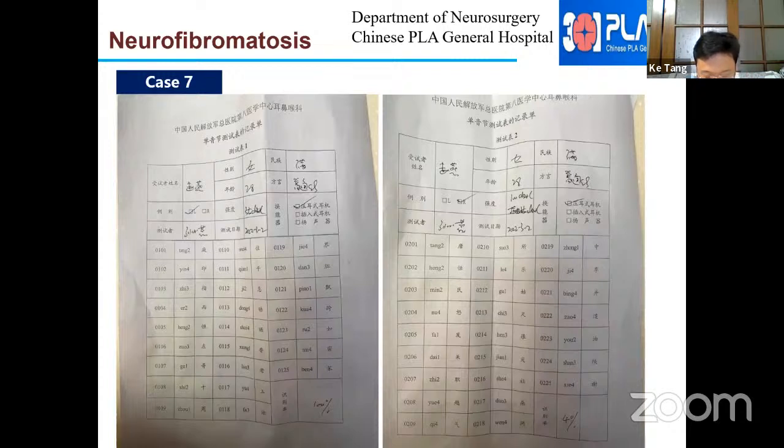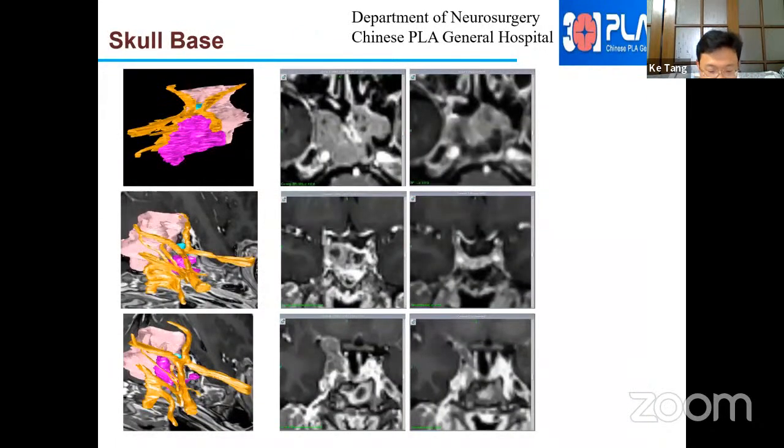The test score of the hearing of the right ear was somewhat increased. We could see the successful conservation of the hearing for the bilateral vestibular schwannomas. Using multimodal imaging, we perform visualization of the microsurgical neurovascular anatomy surrounding the lesions.